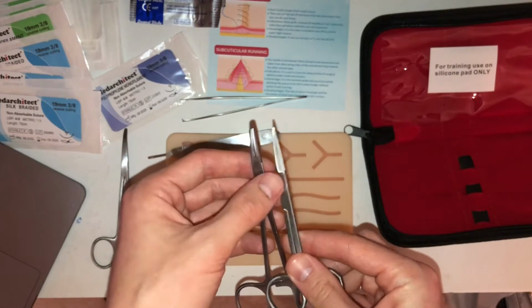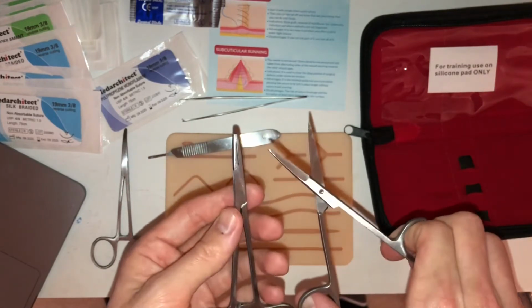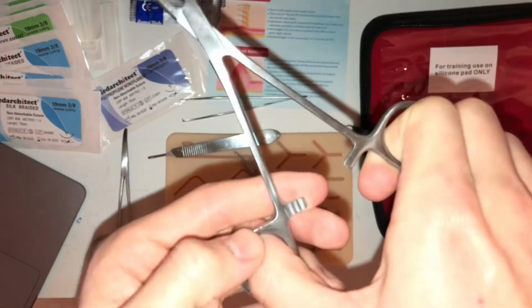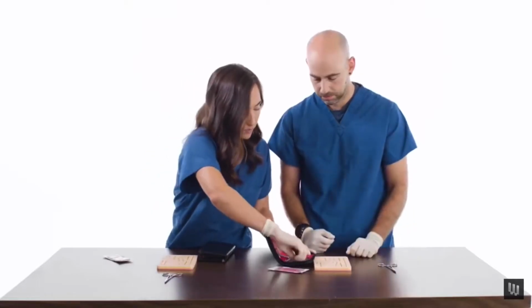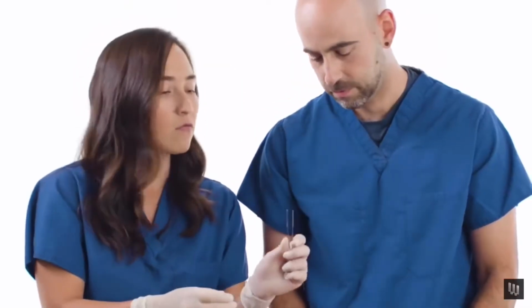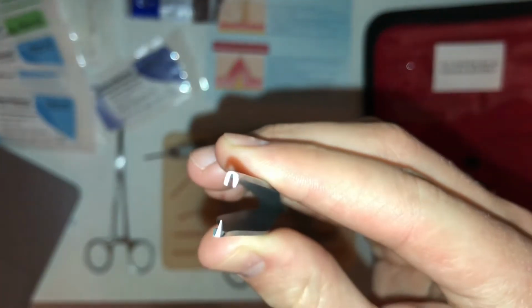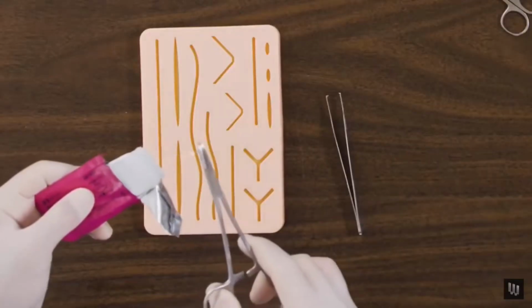This one also seems to be a little curved, while this one seems to be knife-like, kind of like scissors, while this one doesn't seem to be as sharp. It's got a little mechanism down here to lock it. Pretty smart. And then you also need these pickups. These are rough approximations of Adson forceps with teeth. These are the pickups we're going to be using. You can see that was the bit of the teeth she talked about, how those go together like that. Good. Take the whole thing out?